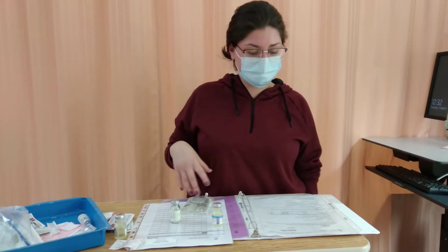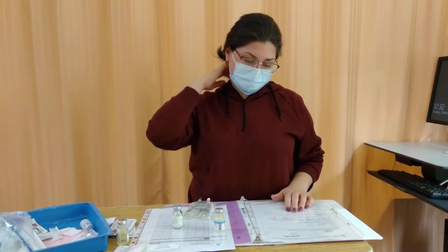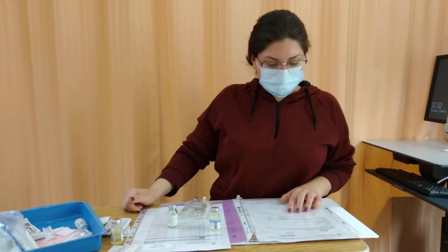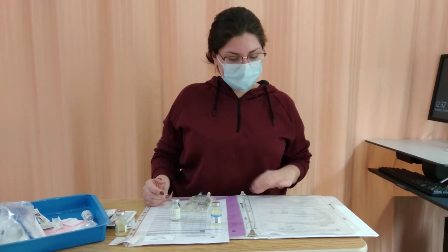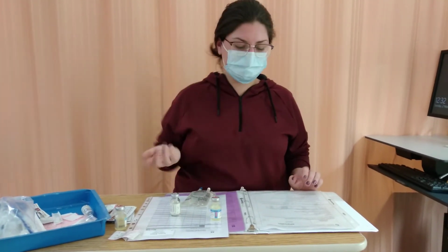We can either give 50 or 100 milliliters of normal saline, which is the preferred one, or we can give D5W. So we're just going to go ahead and choose the lowest volume because there's really no need to give him an excess of fluid. We're going to administer it over 10 to 15 minutes, and I'm going to choose 15 minutes.